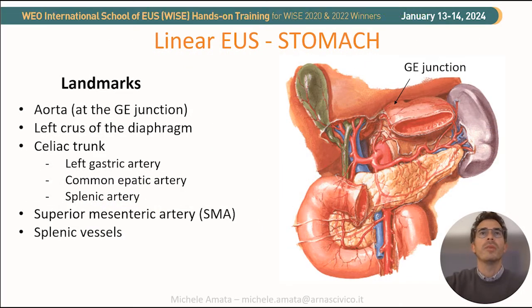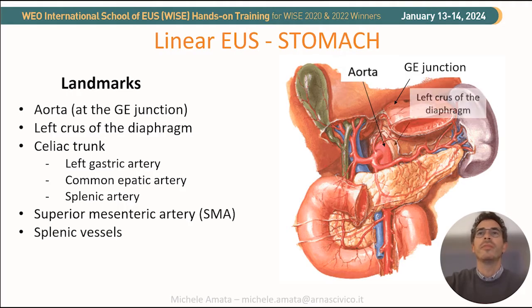The landmarks for US delineation from the stomach are the aorta, the left crus of the diaphragm, the celiac trunk and its branches, and the superior mesenteric artery and splenic vessels.